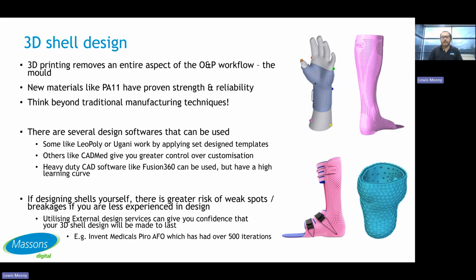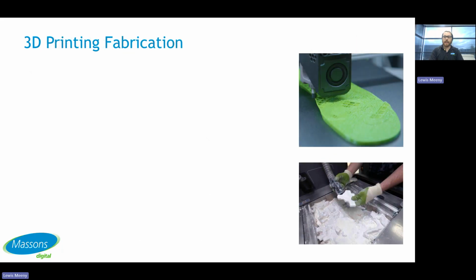on experience. An example here, like this pink AFO on the bottom left, the Invent Medical Piro AFO, had over 500 separate iterations before it ended up here. So definitely leverage the knowledge of the other providers, especially if this is something you're trying for the first time. So that's about the design of 3D prints, but what about the actual fabrication?